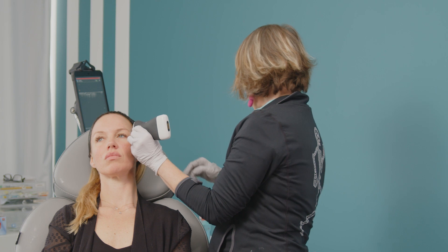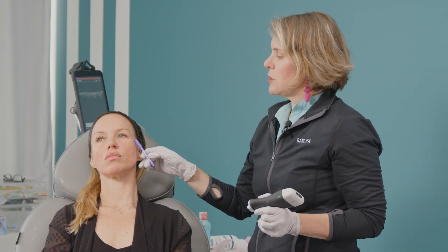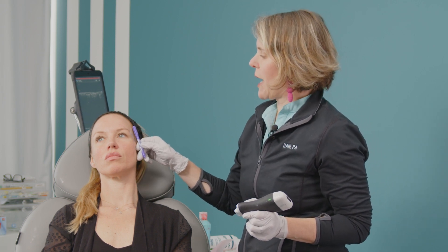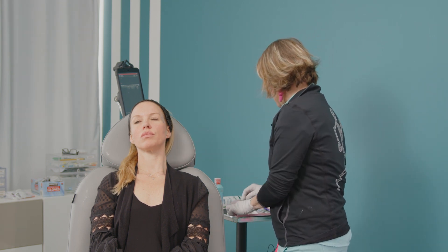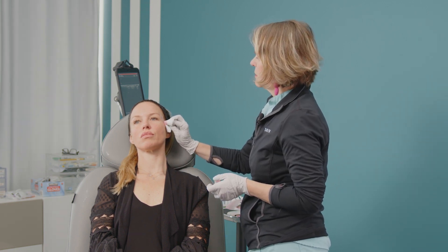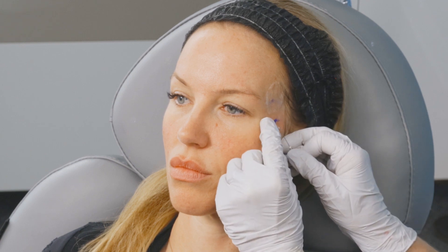We've already marked the bottom of our probe, we've checked it in the wild and saw what it looks like. The bottom of the probe is here — we've made that machete path through our jungle and we see what's ahead. It shouldn't scare us because we're going to be able to stay right above it. I've already injected this spot with lidocaine, and now I'm using Hibiclens to re-clean off the entry point — our point A to point B little jungle path.